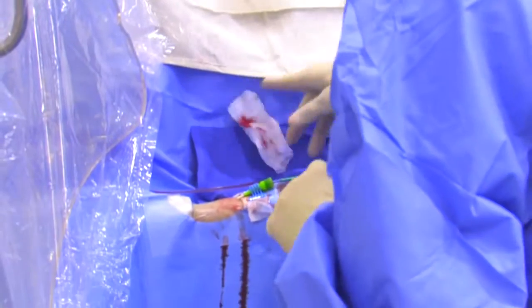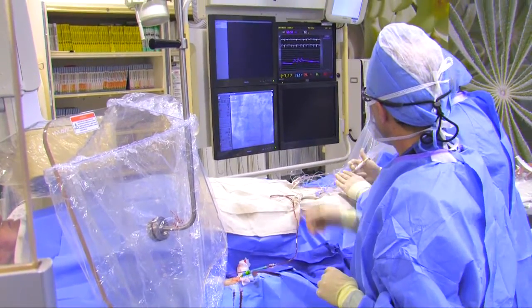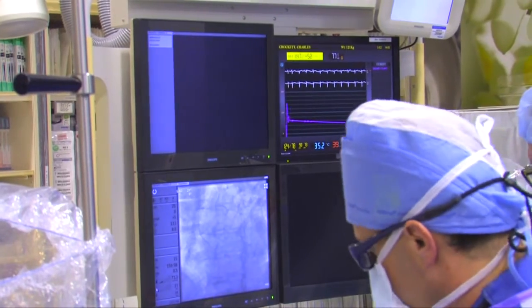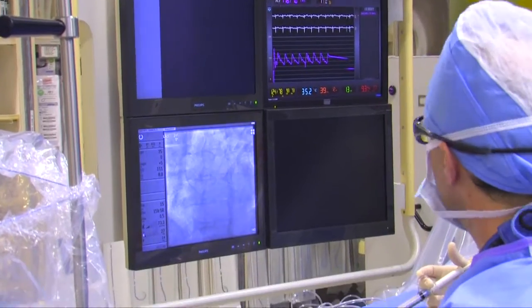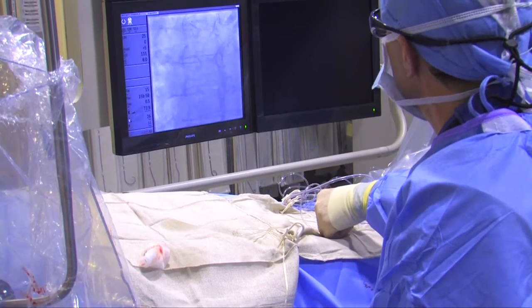That's what Steve is doing here. This catheter also allows us to monitor the patient's pressure, and we see that on the screen along with the heart rhythm and oxygen level. We monitor all these things during the procedure. Steve is just flushing everything, making sure it's all good. Now we are going to insert the catheter into the artery.